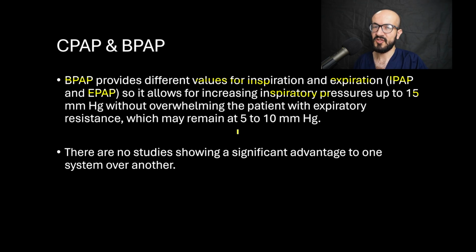The expiratory pressures remain around 5 to 10 millimeters mercury, and the inspiratory pressures can go up to 15. There are no studies showing a significant advantage to one system over another, although theoretically BiPAP sounds better.